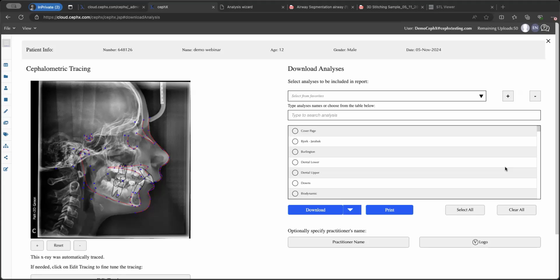You're asking also about a per case payment. We have that option. So if you want to buy per case, you can. There's a minimal cost of 10 cases that you can prepay for. And you're welcome to send us an email, and we'll send you instructions on how to get started that way.